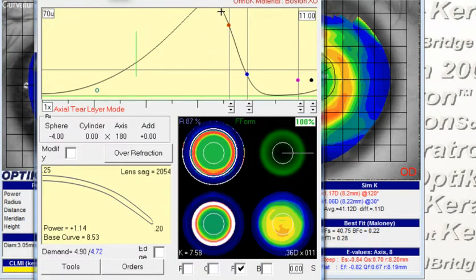So here we have a lens where the OZ is set at about 7.3, which is pretty far out there. And it does seem like it's helping get us a larger treatment zone by enlarging. So I think that's okay. We're getting pretty good centration with the lens, so I'm not too concerned that we don't have very much periphery of the lens aligning on the cornea.